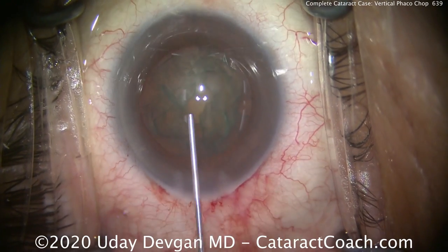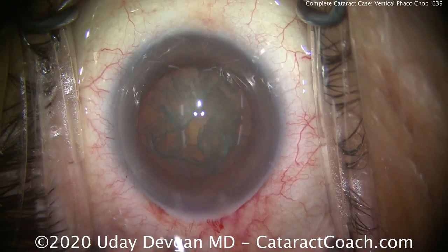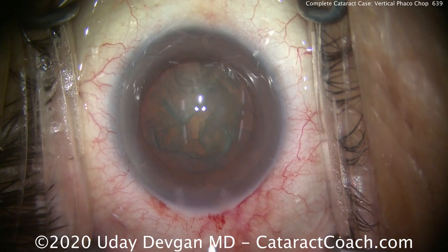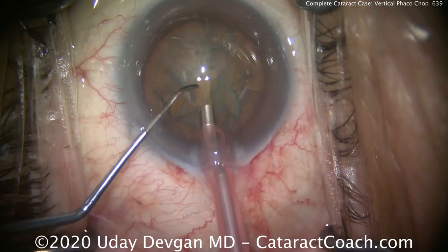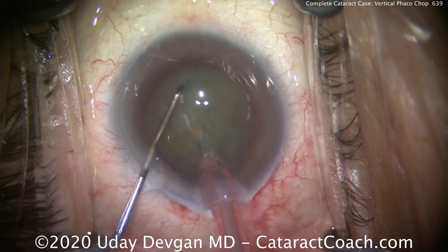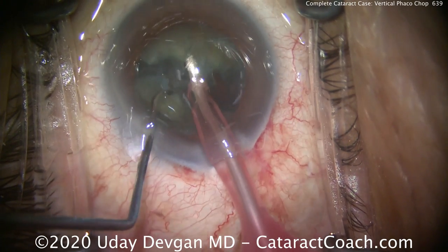Ready to go. Let's recoat the endothelium with viscoelastic. Now comes the phacoprobe, port down — you can see there's the pink sleeve, so it's the 2.4 millimeter sleeve. Here comes the chopper; place that inside the eye as well. Buzz down, dig in the chopper, and the two instruments come apart. We easily separate the two halves.